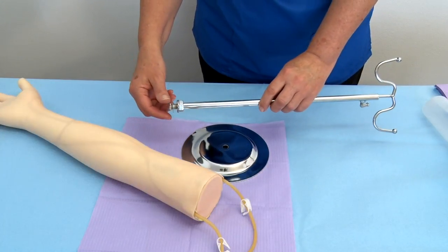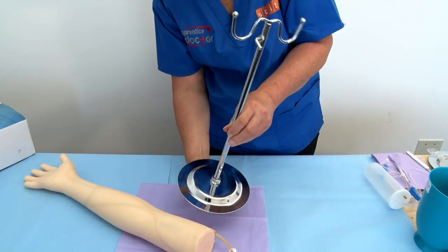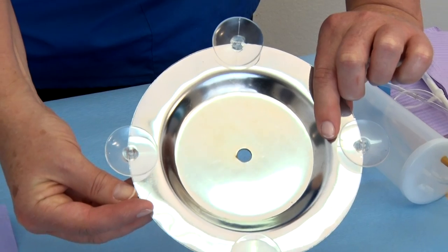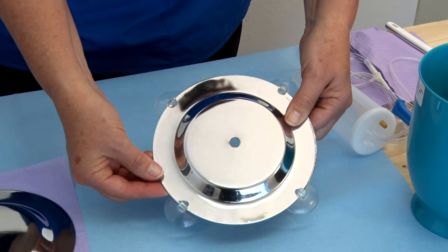Step 3: Assemble the stand by removing the nut and washer and connecting the stand to the base or footpiece. Tie in the nut firmly by hand. Step 4: Some stand models have suction cups that fit into the stand's footpiece — place the cups as indicated.